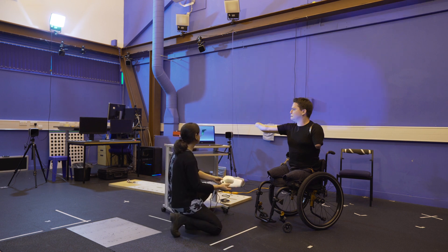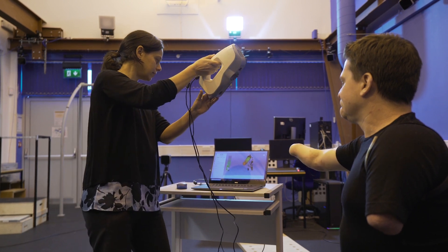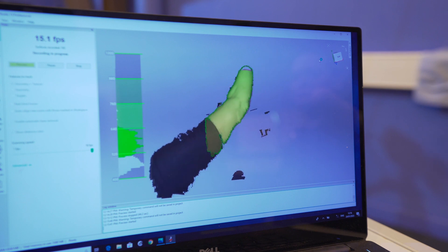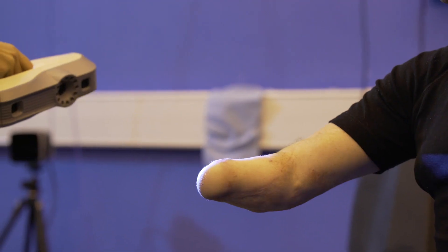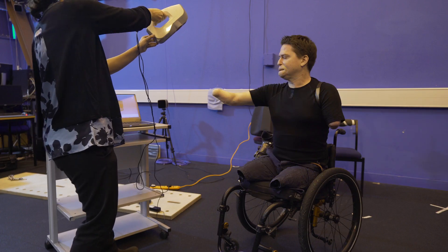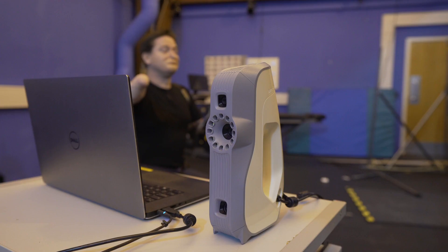When we scan an individual like Alex using a 3D scanner, we collect a lot of pictures and then the software is able to put all these pictures together in order to create a 3D shape of the residual limb that can be visualised on the screen and then used to replicate the shape and create a socket for the amputee. For the clinician, this is really beneficial because the output of the 3D scanner will give them a real and accurate representation of the 3D shape and volume of the residual limb of the patient.